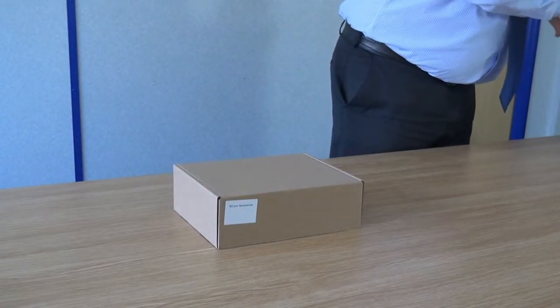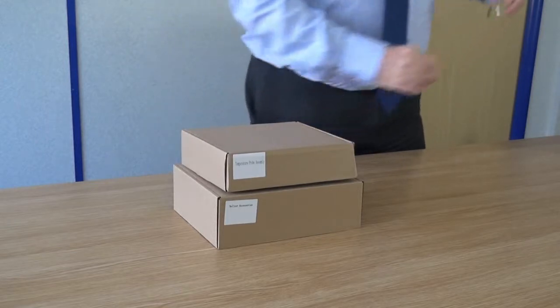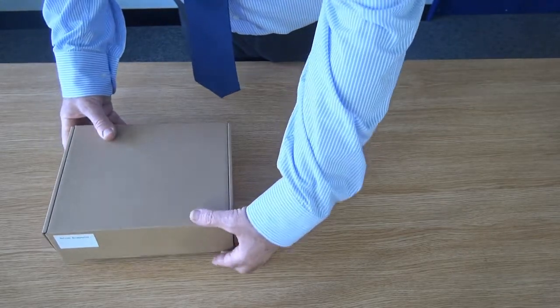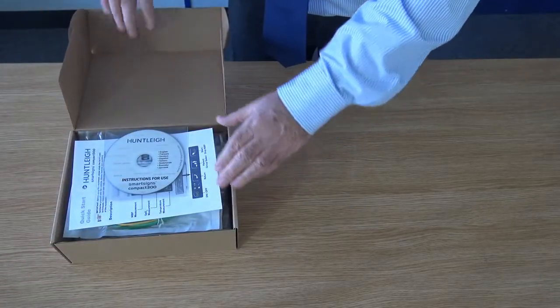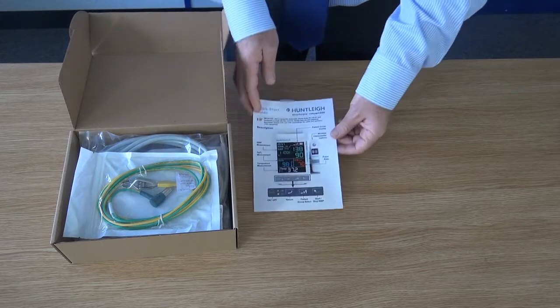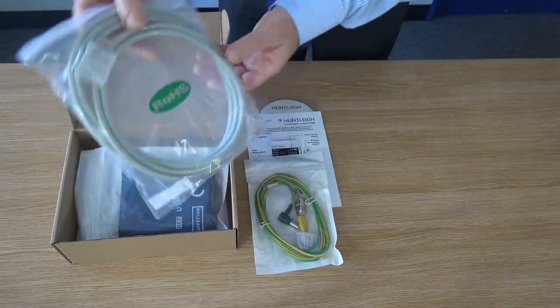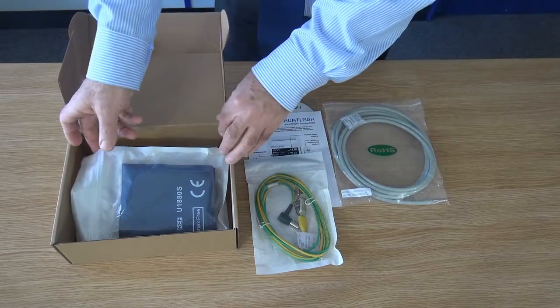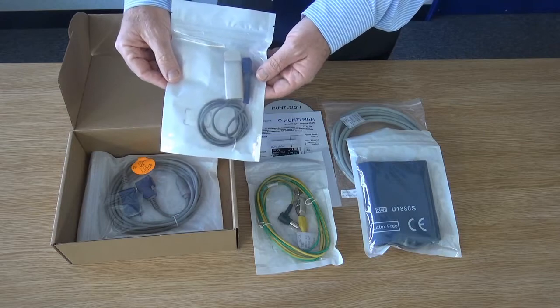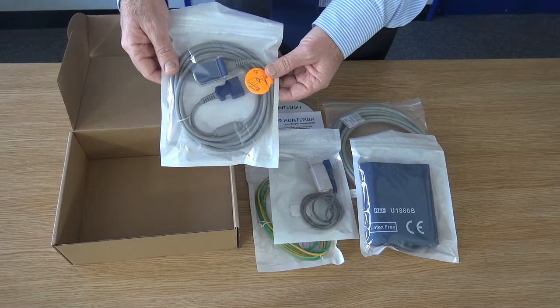Carton number one contains the main accessories. The main accessory carton contains the following standard items: an instructions for use CD, a quick start guide, one earth cable, one 3-metre blood pressure hose, one adult blood pressure cuff, one Nellcor Oximax adult reusable finger sensor, and one Nellcor Oximax SpO2 interface cable.